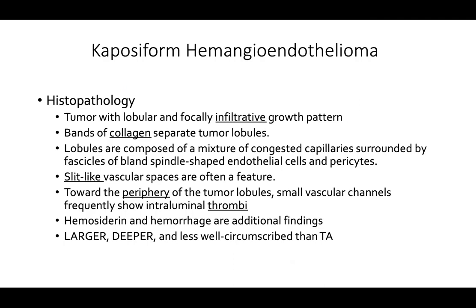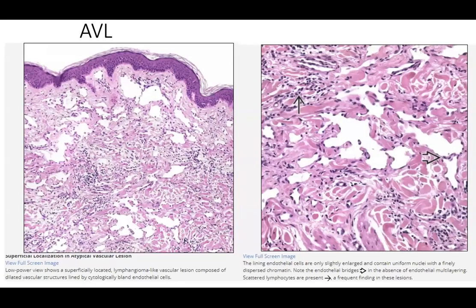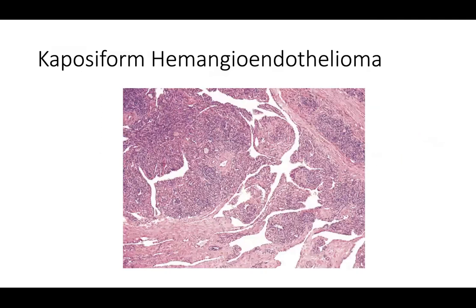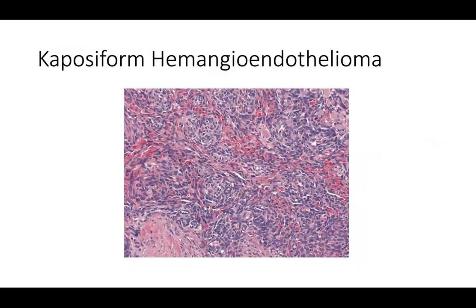Towards the periphery of the tumor lobules you'll find small vascular channels that frequently show intraluminal thrombi. Hemosiderin and hemorrhage are additional features. Kaposiform hemangioendothelioma is distinguished from tufted angioma by being larger, deeper, and less well-circumscribed. At low power the image is more diffuse, at high power the lobules are less discrete, and you'll have more slit-like spaces with more intraluminal thrombi. As intraluminal thrombi form, erythrocytes change from dark red to a more homogenous smeared red and then pinkish color resembling collagen.